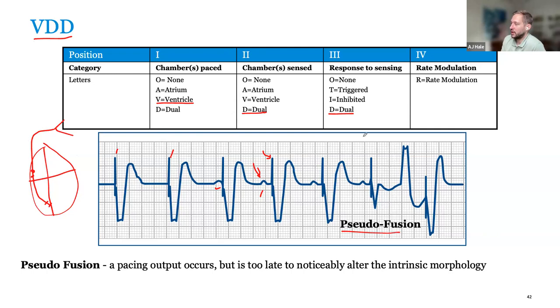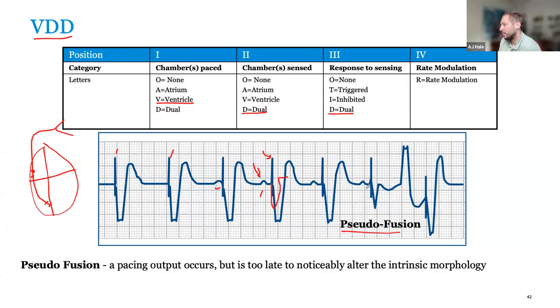This looks like pseudo-fusion. Fusion is when you have a hybrid between the intrinsic and paced event — a narrower complex than the pure paced event but not as narrow as the intrinsic. In this case we see a pace spike, but the complex has already started and morphologically it looks very similar to previous intrinsic events, suggesting the pace hasn't contributed to depolarization. So it's pseudo-fusion — it looks like it fuses but is really functional non-capture.